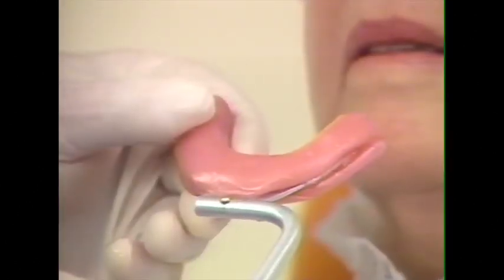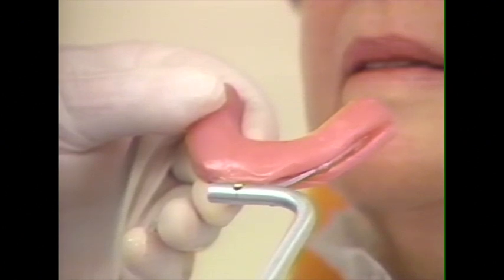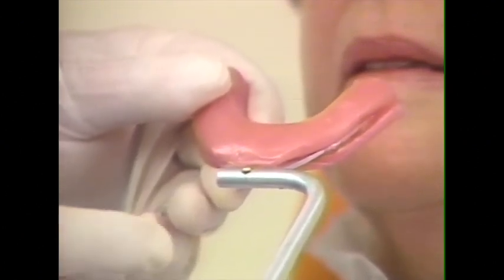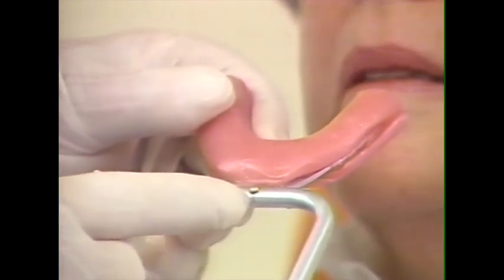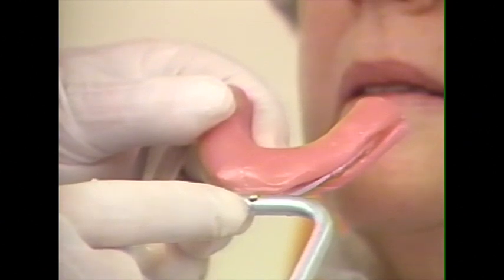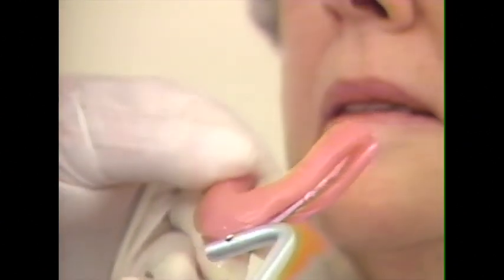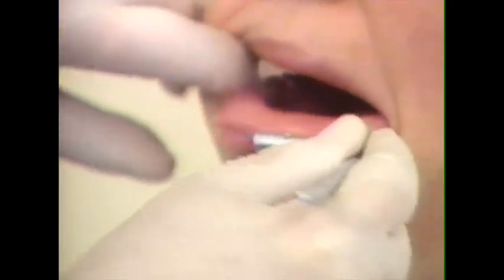First step in securing a Facebow transfer is to take a bite fork record. The bite fork has a brass rivet on the upper side, so it is very important that this be kept upward. We've already softened our wax, and we are ready to insert it in the mouth to secure the record.